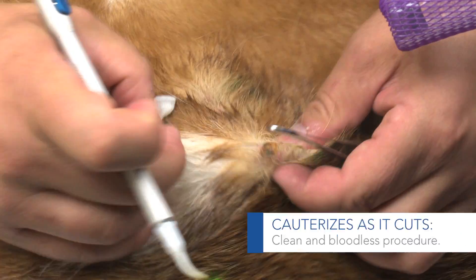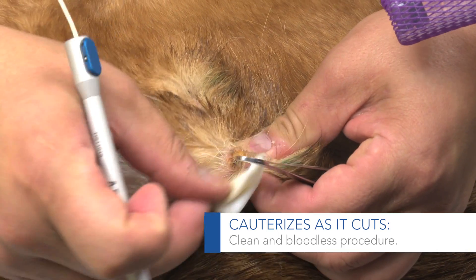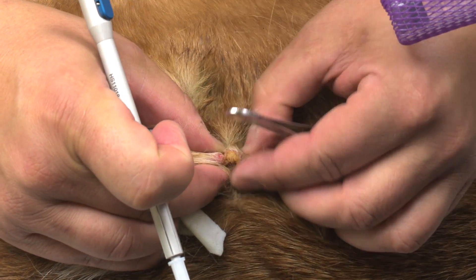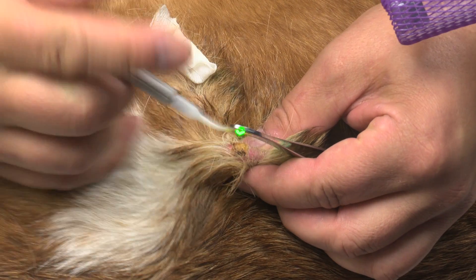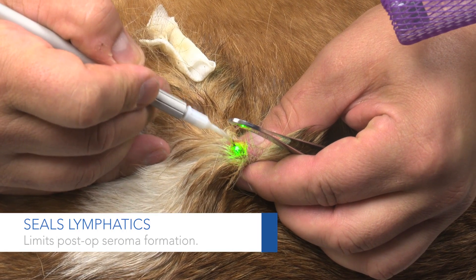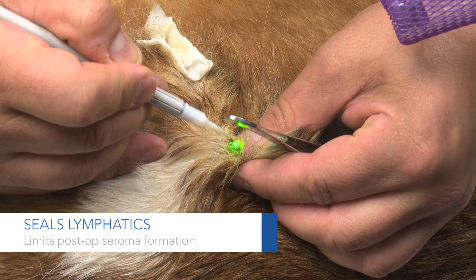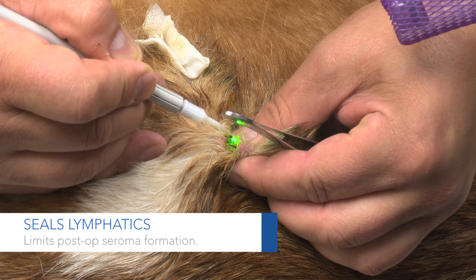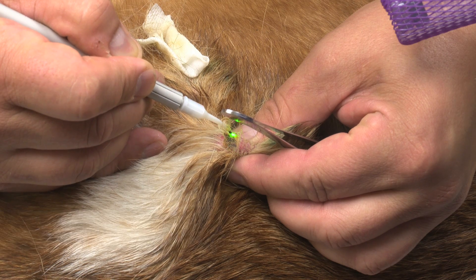The laser cauterizes, so you don't have to worry about bleeding post-operatively. It also seals lymphatics, so especially if you're doing surgery on a lipoma, it'll seal off the lymphatics and you don't get a lot of post-operative seroma formation.